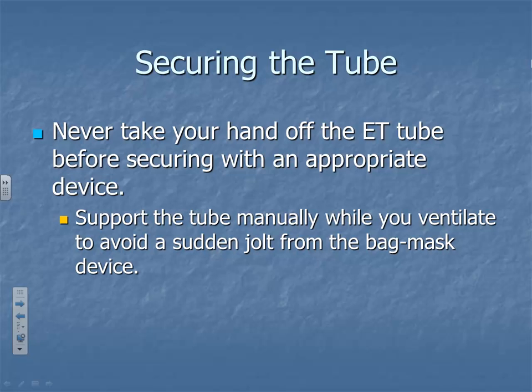Auscultate well. Okay. From the time you place that tube, you need to hold on to that tube until you've got it secured. I can't tell you the number of times I've seen people set the tube and then go off scrambling around for all of their stuff. No, you don't leave a tube naked there unsecured. It's either got to have your hand on it or it's got to be secured. There's no other opportunity for you. So before you do your intubation, make sure you've got your securing materials right there.